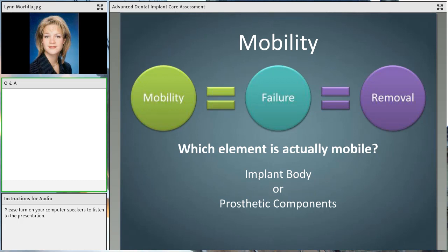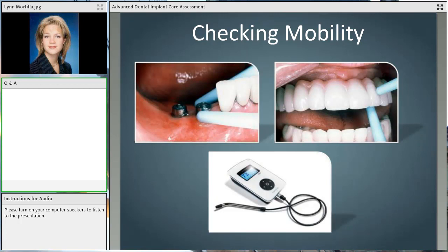One of the main ways we look at to decide which one is possibly the culprit, is it the implant or is it the prosthetic piece, we can use our air water syringe tip. If the mouth pools with a little bit of saliva, or we blow a little bit of water in there and we blow our air water syringe tip, we blow some air in, oftentimes if it's an interior prosthetic screw that is loose, you'll see some little bubbles of air that is escaping from around that screw, and you'll see a little bit of percolation. So you can try to rely on that if you're sensing some mobility, but this is definitely a time when the doctor has to get involved to see what's going on.